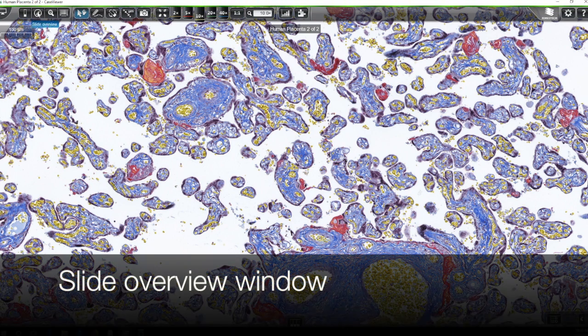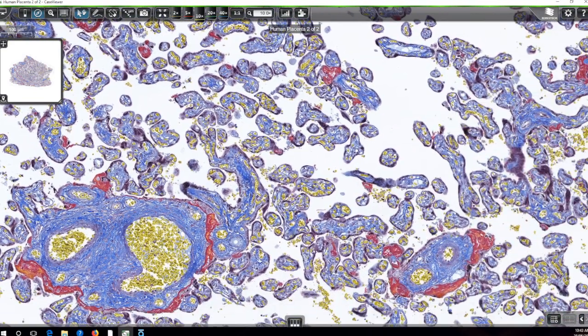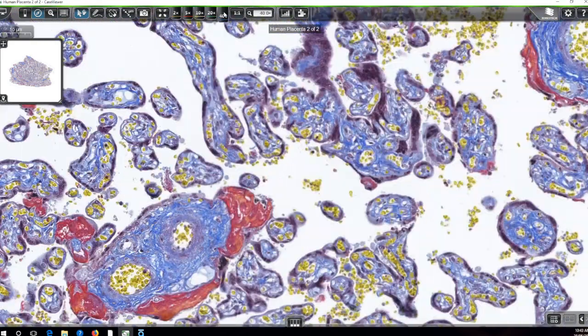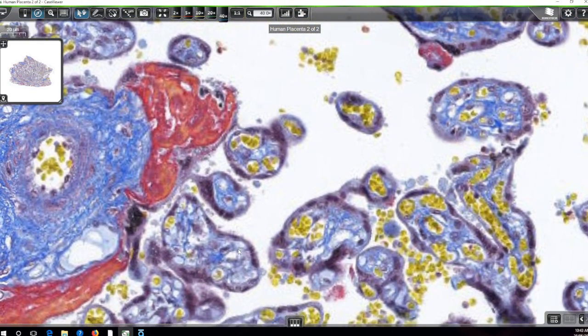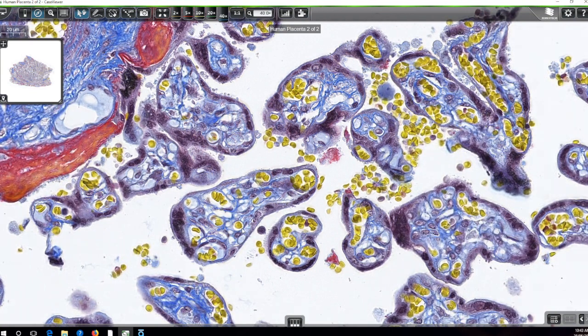Now so that we don't lose where we are, there's a nice option to bring up a slide overview window. And the value of that is at any time as you're scrolling around, you can see in the left hand window there exactly where you are in relation to the whole surface of that tissue.